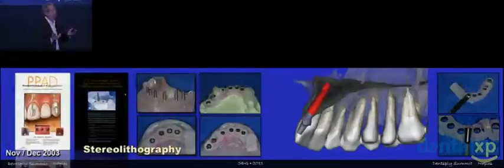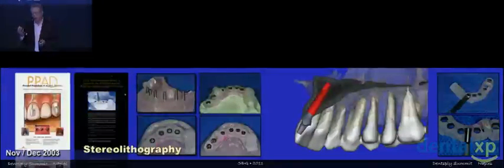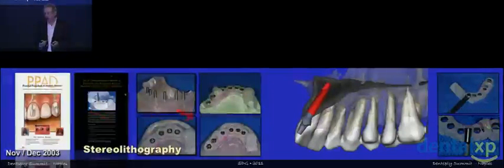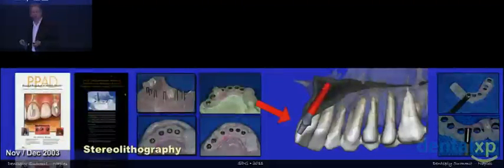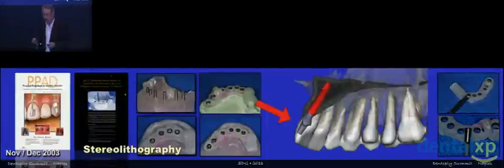And then, of course, the invention and the application of stereolithography has been a catalyst for this focus. And, of course, that allows us not only to create a bone model of the patient, maxilla or mandible, but also some of the templates that we utilize, especially those that are fabricated by Materialize and some other companies.